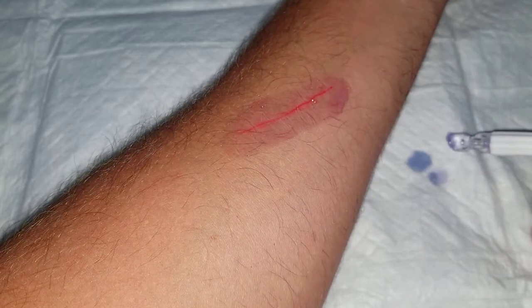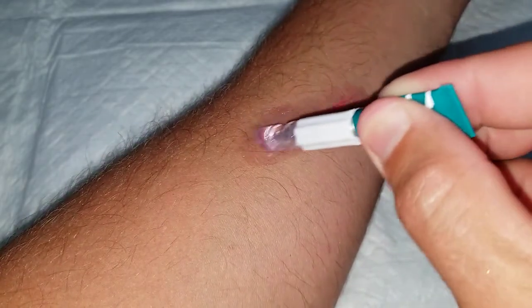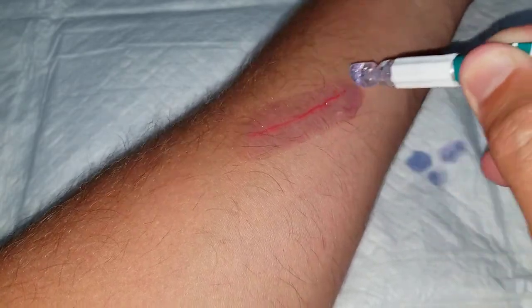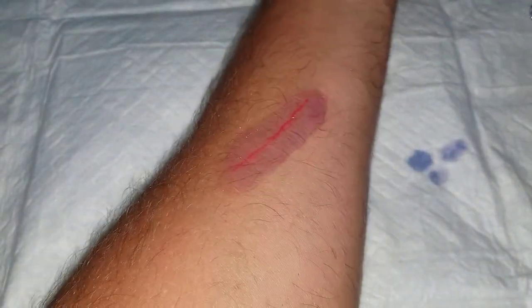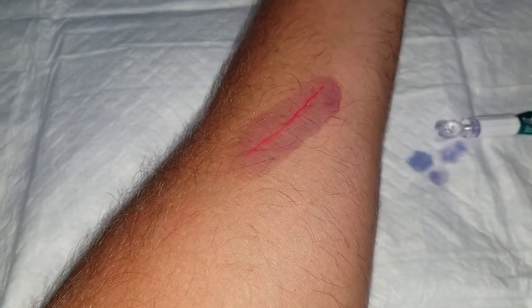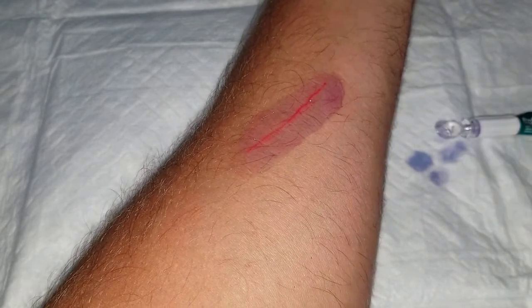So then what I'll do is get a little bit more glue, go over the top of it again. I just like to build it up and get it a little thicker if I can, especially on the edges. Now this is only to remove it, like I said. So usually that right there with that much purple, you're usually pretty good. We're going to have to give it just a little while to dry. That's pretty thick on the edges.